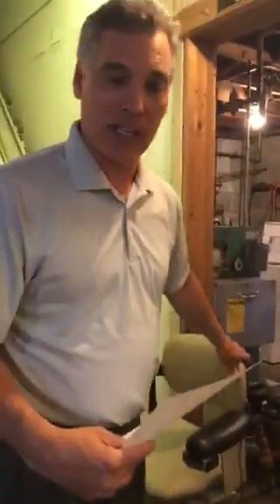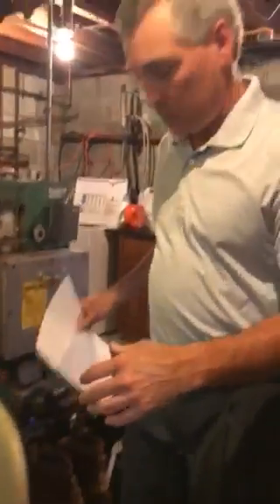One of the most common stair lift repairs is that the stair lift is unplugged. We get to the customer's home and they say it's not working — it's real simple. We go over to the outlet and check to make sure it's plugged in. Many times, in this application, they have the stair lift plugged into an extension cord that goes up and around and plugged into an outlet. Just make sure the stair lift is plugged in.